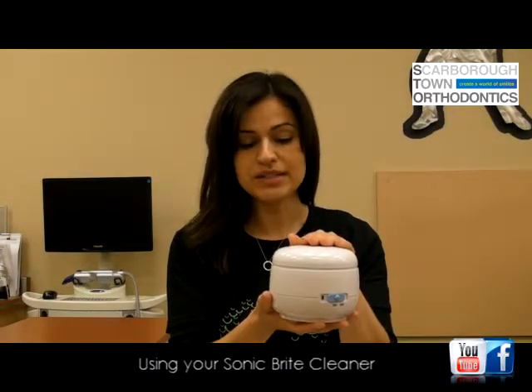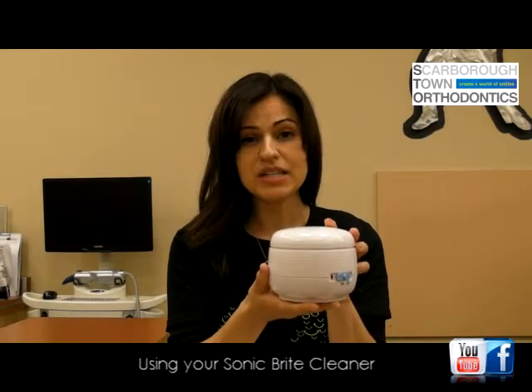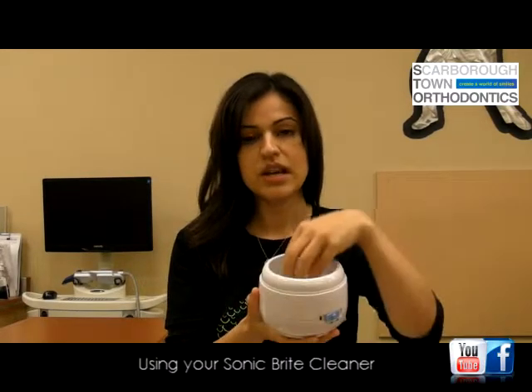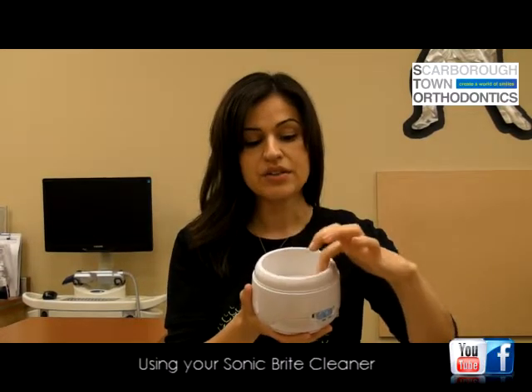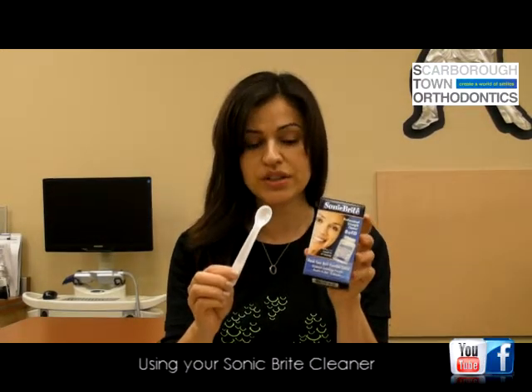You will be taking home today a Sonic Brite unit, and Sonic Brite is a cleaner for your aligners. Batteries are not included, and you're going to use this once a day to keep your aligners extra clean. So inside you're going to place your aligners. There's a fill level, so you're going to follow that. Just add some water to the fill level. And it also comes with a powder cleaner and a teaspoon. So you're going to add a half a teaspoon to the water to create a cleaning solution.